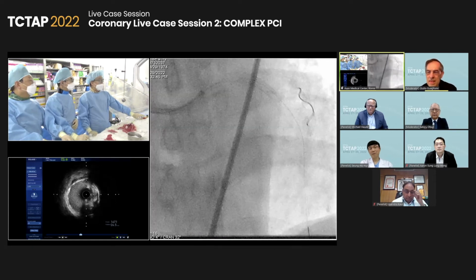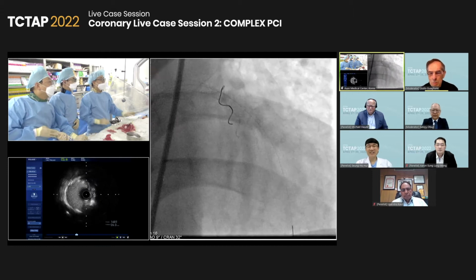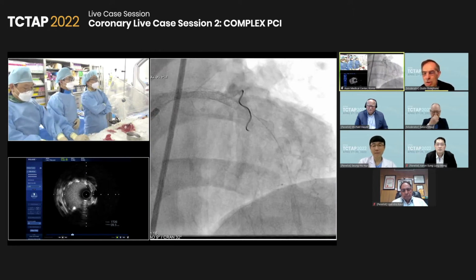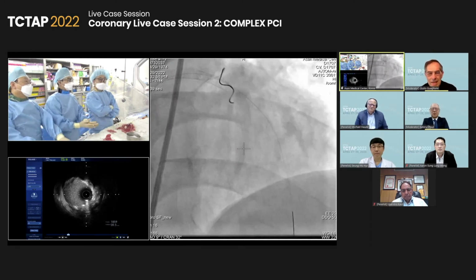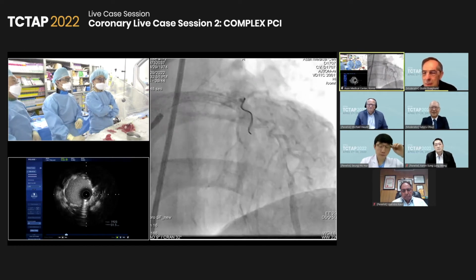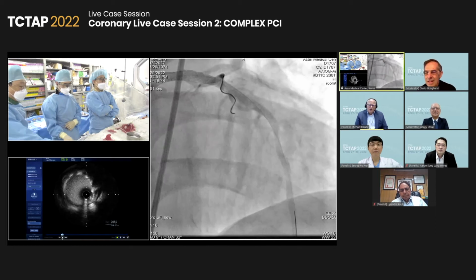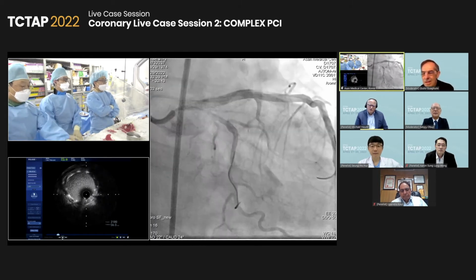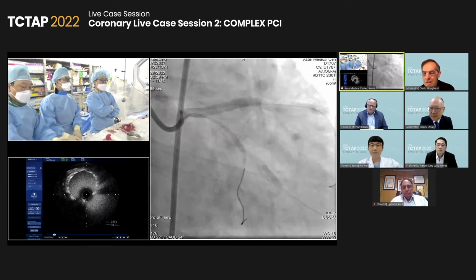While you're checking, I'm asking because I'm not sure that we'll have 100% agreement on whether to open up the ostium of the circumflex. Michael, your opinion, very sharp. I think you need to rewire the ostium of the circ and at least do a kissing in order to open it.